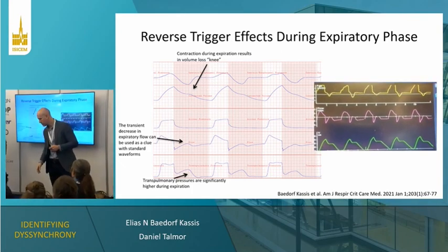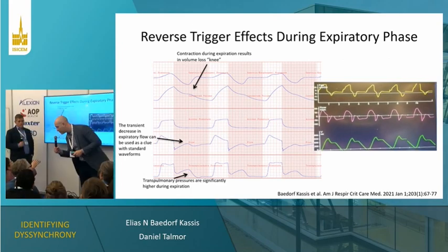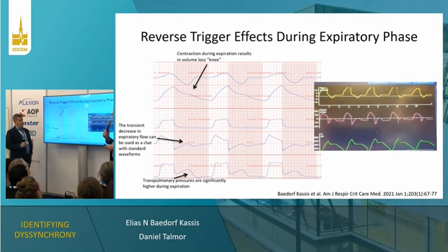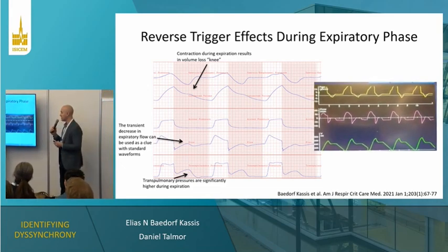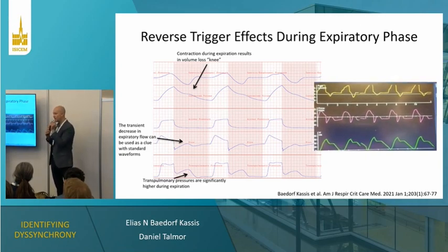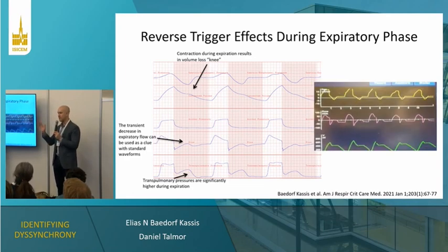How can you differentiate it from mistriggering? It's a great question. Obviously during exhalation, it seems like this could also be a mistriggering event. It's the coordinated, tight coupling of the activity. It's the regularity of it. Mistriggering is oftentimes not regular; you're not going to see it with this regularity.